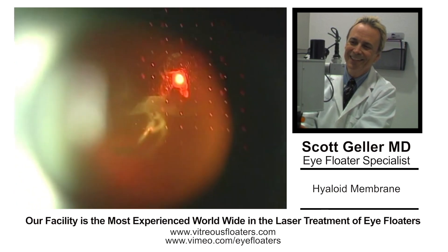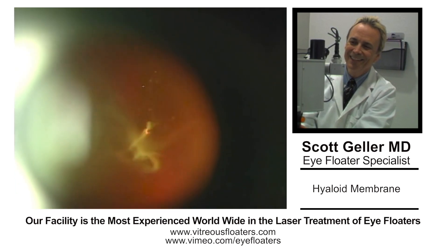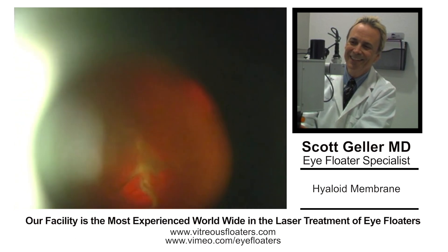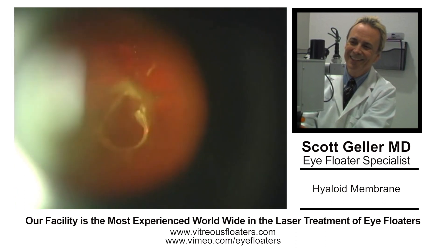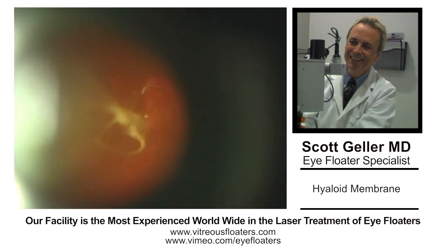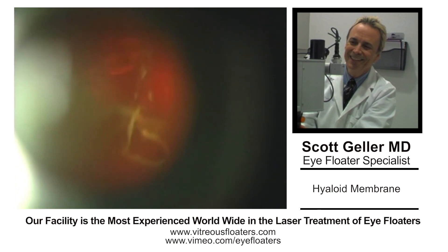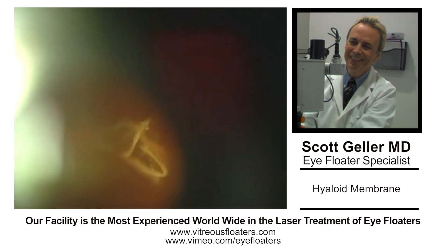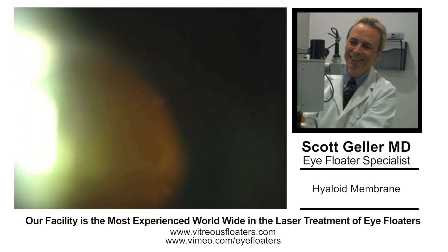The strategy here is something that you develop while looking at the opacity. I'm looking at the Weiss ring hyaloid opacity and the thickened hyaloid membrane from a posterior vitreous detachment. Our strategy is to cut the Weiss ring away from the hyaloid, creating a window. The window will retract both laterally and medially, allowing the patient to see clearly again. This patient is a phakic patient in his 50s. He was offered a vitrectomy but did not want to proceed because of the risk of cataract and other possible complications.